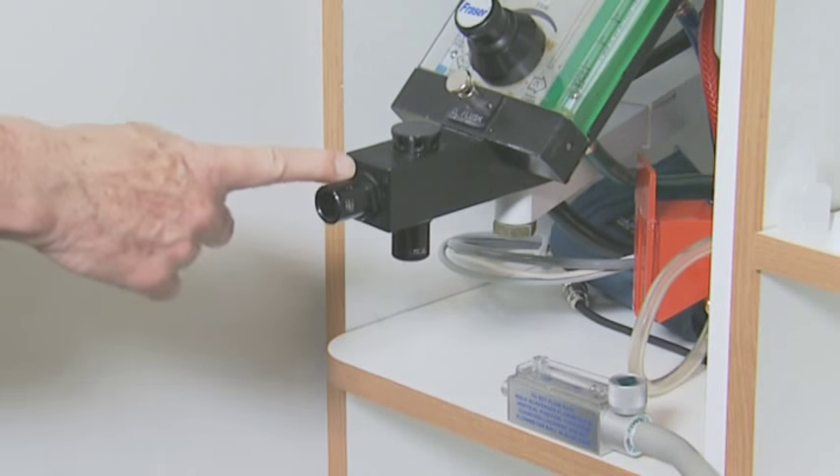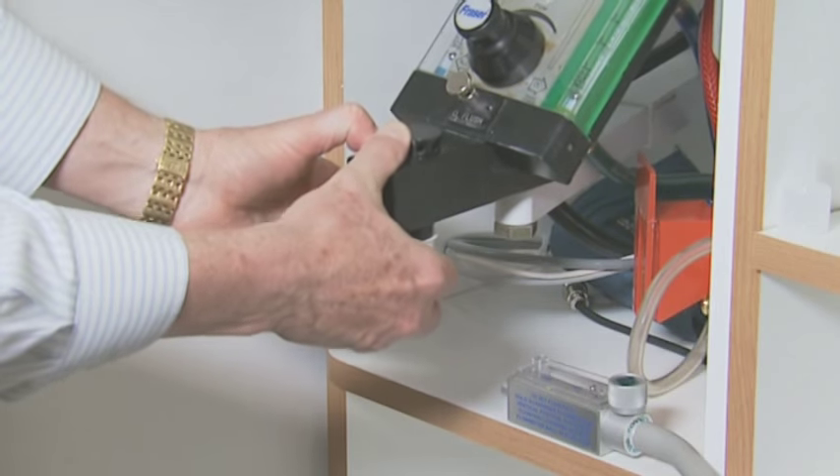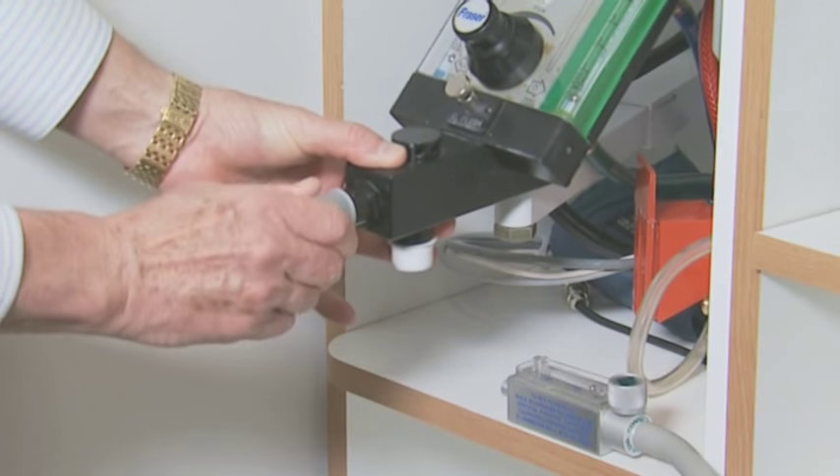We can cap off where the bag was, and we can put an adapter over the 22 millimeter fresh gas delivery port.